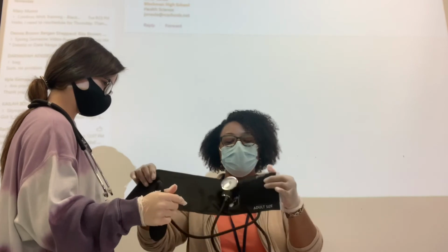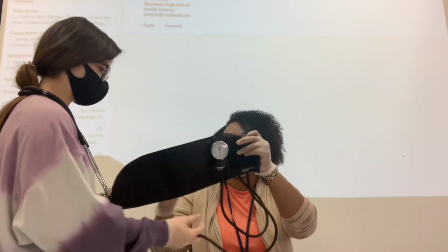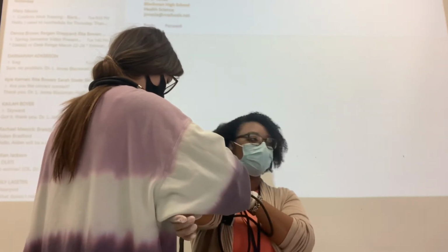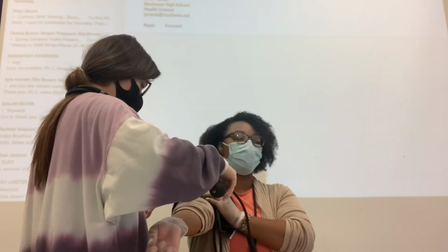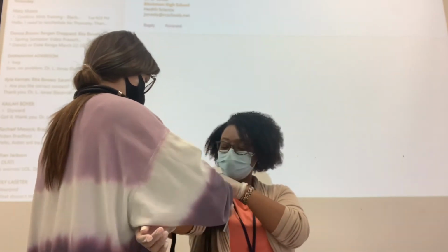All right, so everybody looking? So this is the side she's going to put on my arm. So I put my arm out. And where the gauge is, it has that arrow for artery. We're putting that where the bend of our arm is, right? Okay, so let that go. Now wrap it around my arm.